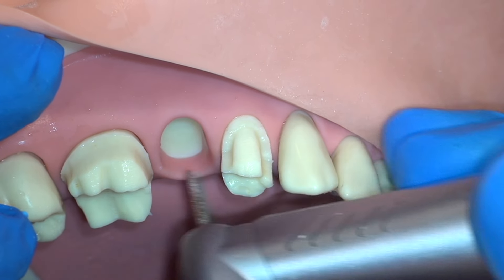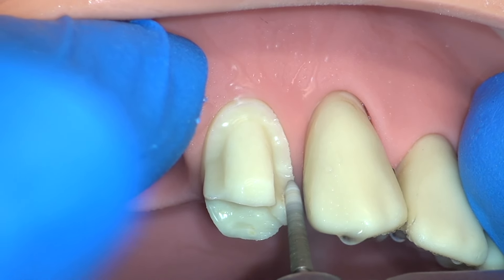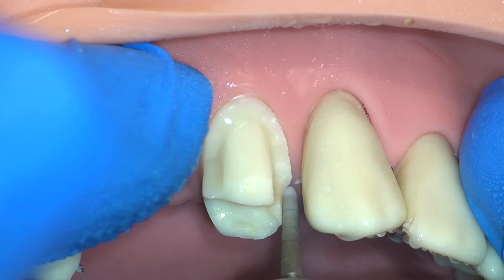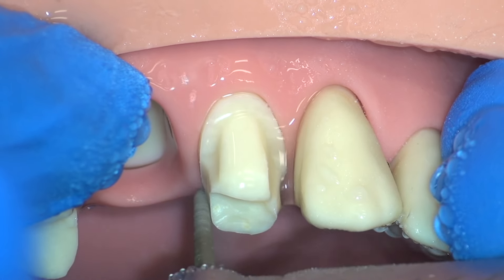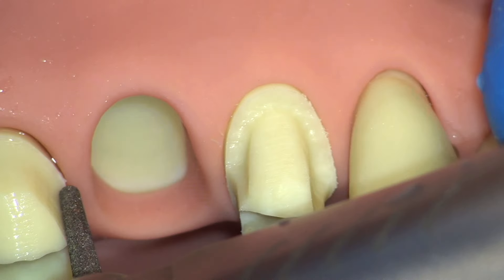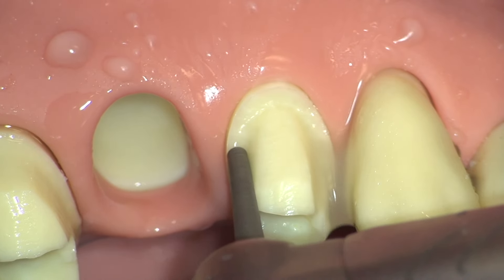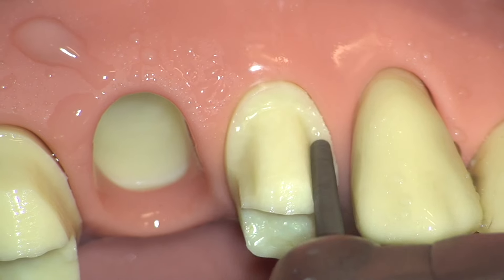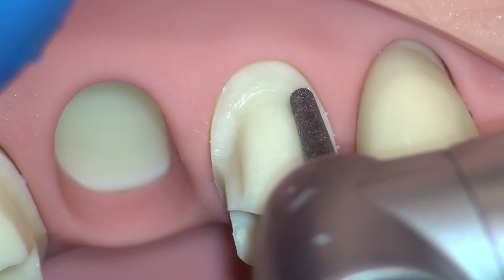Next, we'll continue with the chamfer interproximal reduction for the premolar, considering both teeth and the path of insertion. Here we can see that we've already begun to correct our distal angulation and we'll continue to do so as we work. Reduce the bulk, watching the tip of the bur to ensure adequate axial reduction of half of the bur. Switching now to our red modified shoulder bur, we'll complete the buccal reduction of the premolar. Here we can see the dramatic correction of the distal angulation, but without increasing our axial wall reduction. Thus, we are increasing our TOC, but we can see that it is still acceptable, and we will assess this in the context of both teeth. Now we use the tip of the bur to assess the width of the finish line — remember, it should be 1.2 and the tip of the bur is 1.